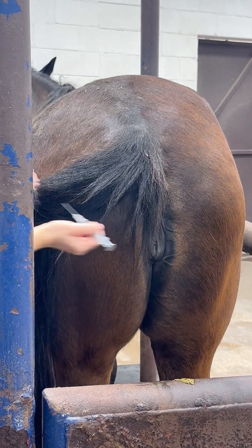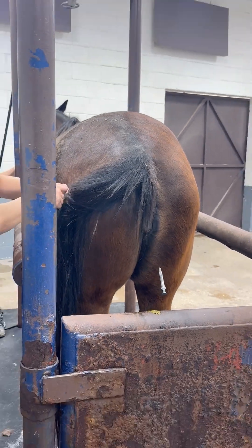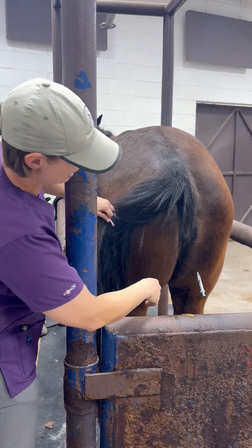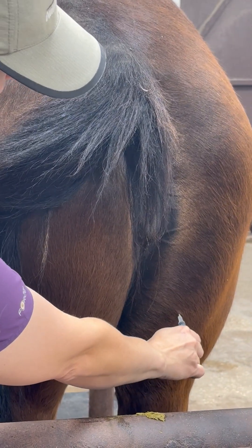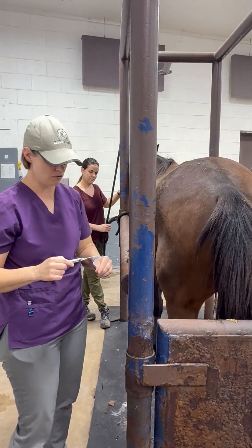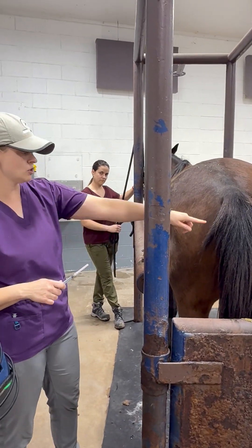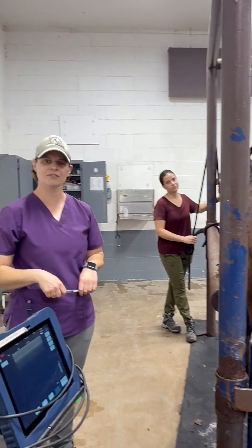The way I do it is pat, pat, pat to get the horse ready, and then stab and let go — so if they shift, it's not going to come out. Then reach around, draw back, no blood, and give. I always stab the leg that I'm not standing next to, because if they're going to kick you, it's usually with the leg that you just poked. So those are the three places that you can give an IM shot.